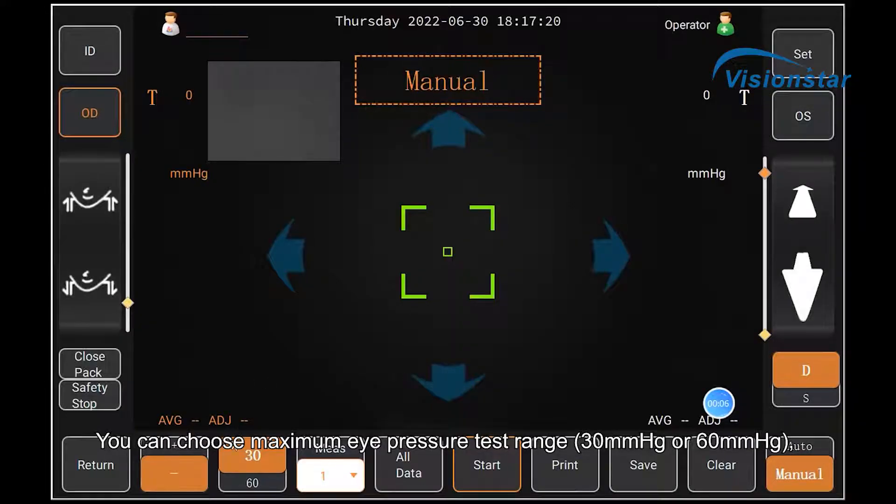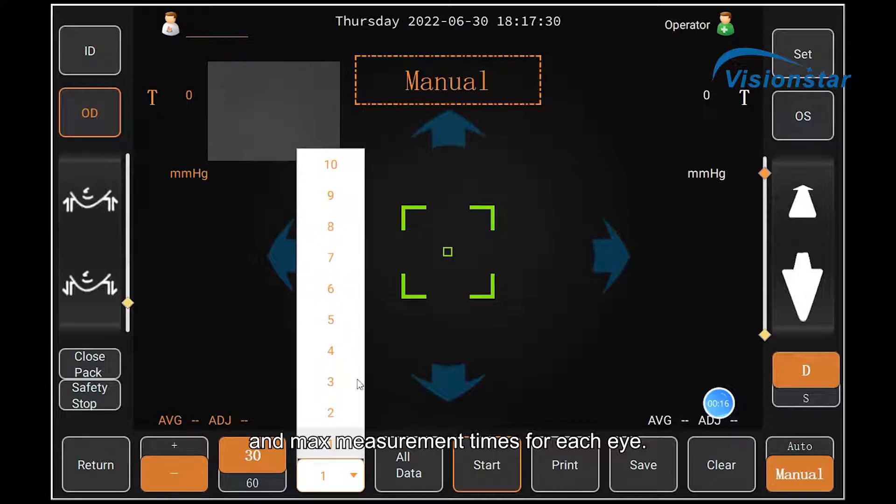You can choose the maximum eye pressure test range — 30 mm of mercury or 60 mm of mercury — and the max measurement times for each eye.